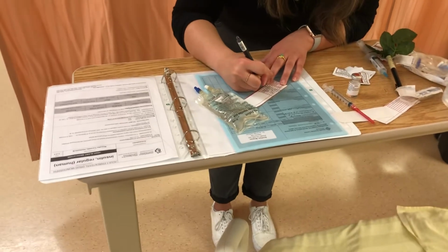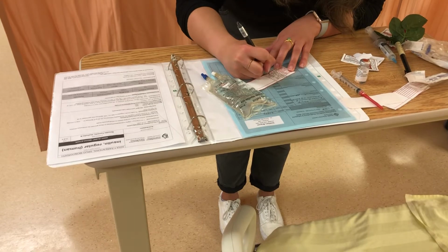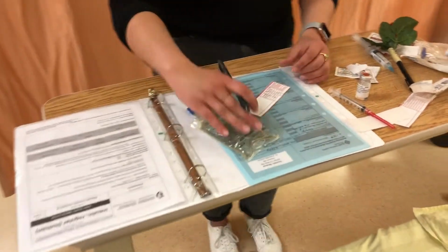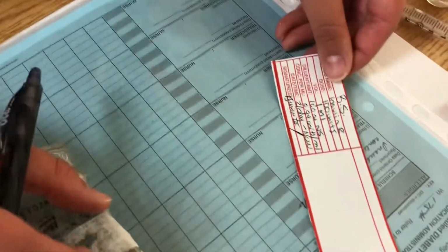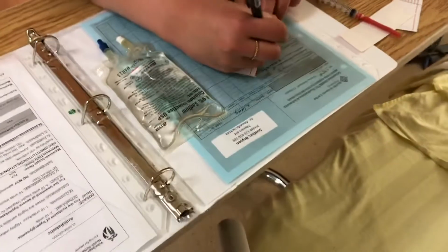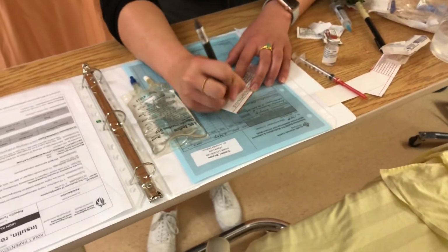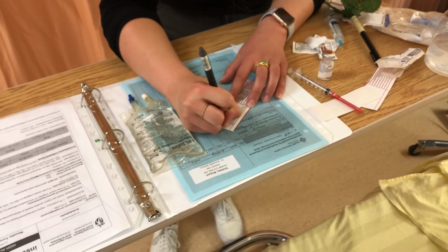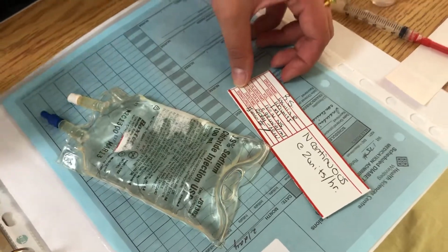In a real clinical situation, I would swab for 30 seconds and wait 15 to dry. And in a similar manner, I would inject some air. And then I would have my second nurse sign this as well to ensure that they have also completed their second check. So here's my label. I still have to add to this part. So that is my completed label that I will put on my mini bag.